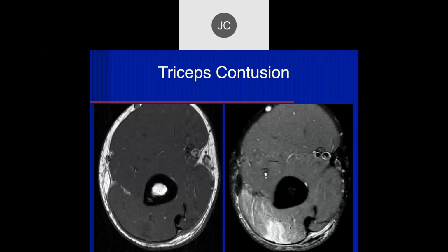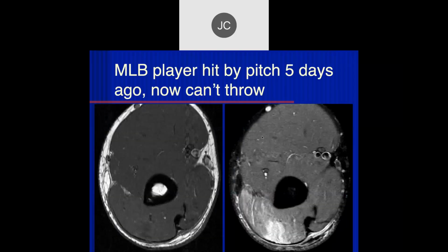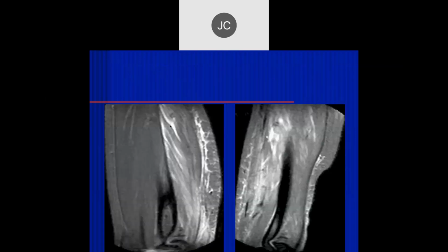But this is typical of contusion. This is the center part, and then the kind of peripheral hemorrhage, as opposed to a grade 1 strain, which looks like this. Typically a grade 1 strain looks kind of similar with this diffuse edema, but with grade 1 strains, especially for these kind of muscles, you very characteristically will get this edema along the muscle fibers, as opposed to just centered here in a conglomeration. Now, I don't know that you could reliably in a large series differentiate contusions from grade 1 strains by using these criteria, but this is typical of contusion, and this is typical of a grade 1 muscle strain, a strain injury rather than a contusion.